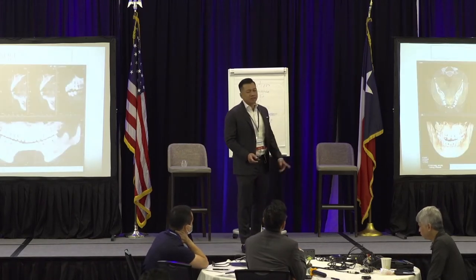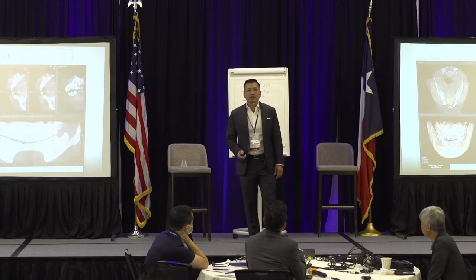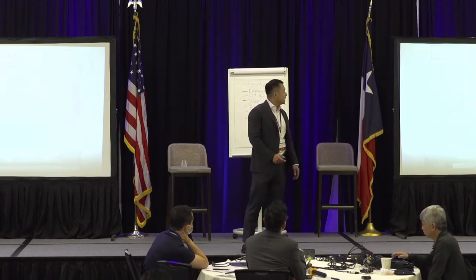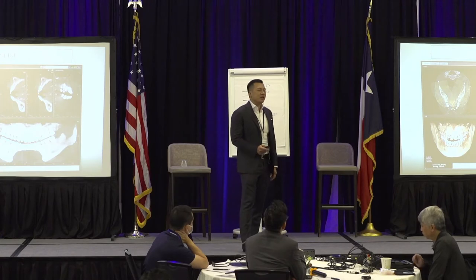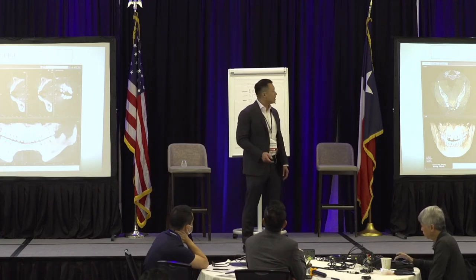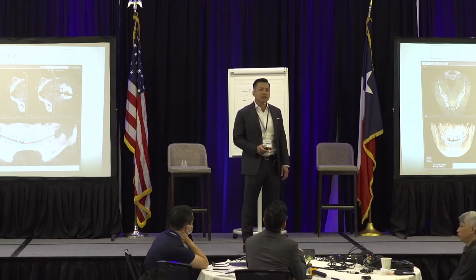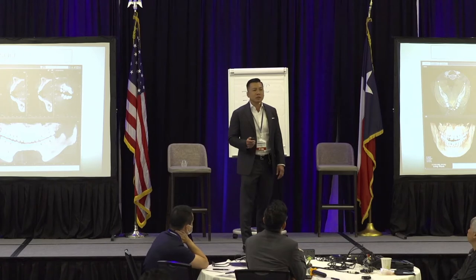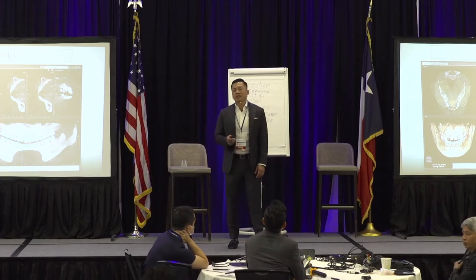So first CBCT slice, you can't really see it with these projectors. It's about 3 millimeters and 4 millimeters on the ridge. You're also going to see, this was my first CBCT. It was a Gene Array, but now I have a Prexion with Stefan in the back there. You're going to see a lot better image. You can see the ridge there. It's going to be hard to place implants there, especially a bridge with 3 to 4 millimeters. So what do you do? You can do a bridge, a traditional bridge on crowns, but like I said, the patient didn't want that.